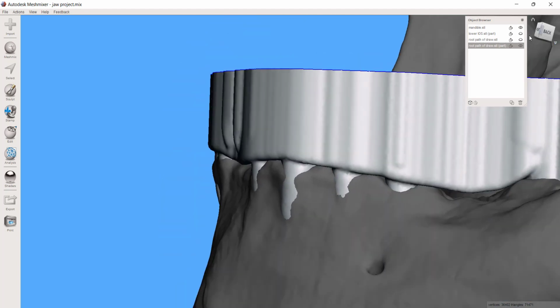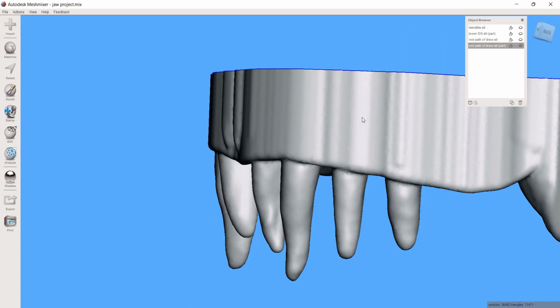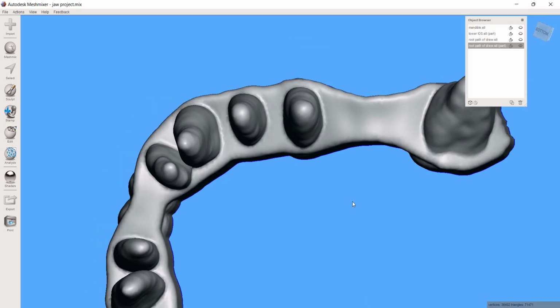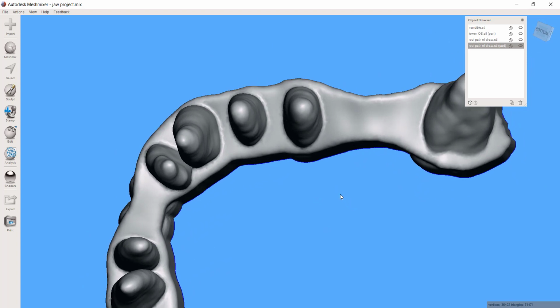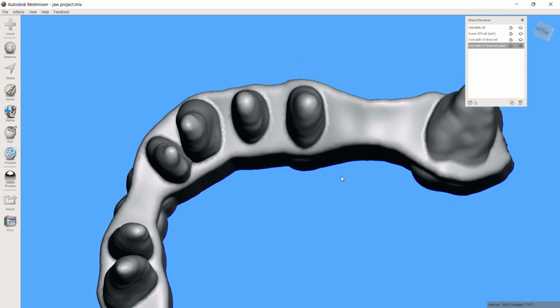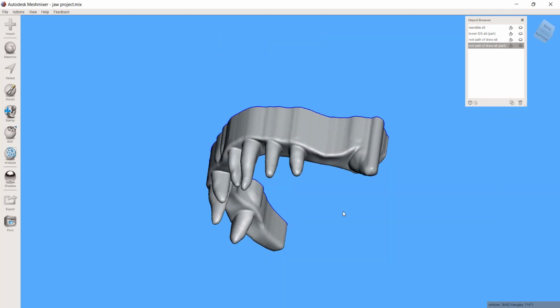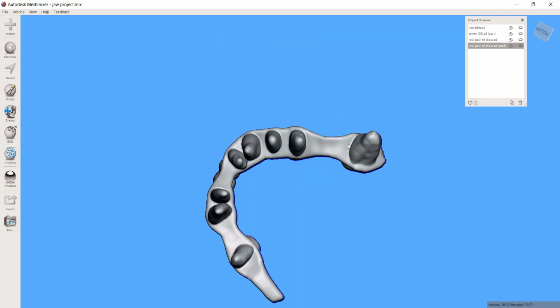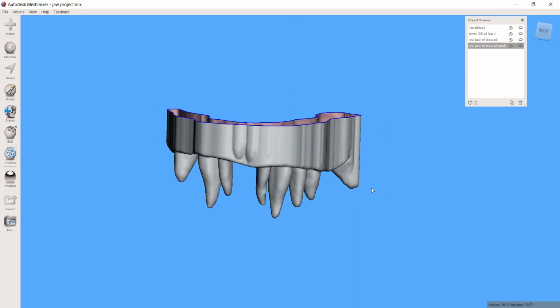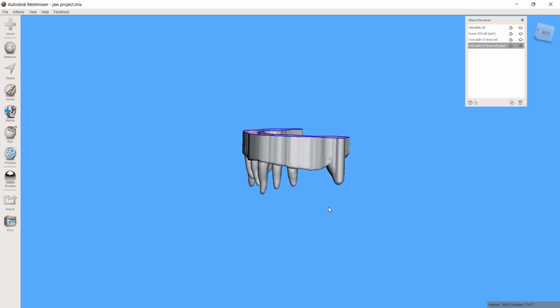Now I did just think of one issue, which is we're not going to go to the trouble of simulating gingiva. I mean, we could do that, but that's a lot of trouble. It's really not necessary. And so I really would like to cut away this portion. Let's act like this is the implant in question where they're going to do their simulated implant placement.